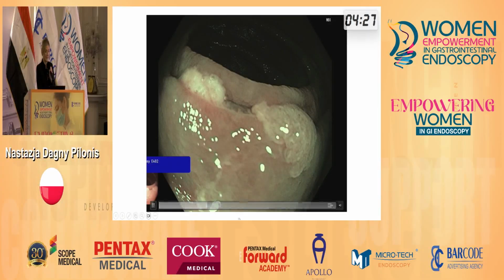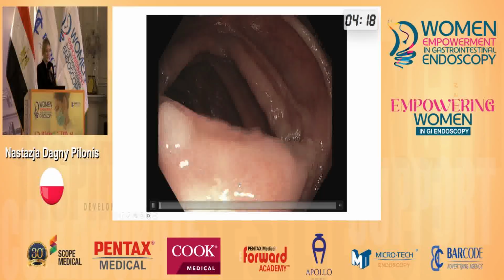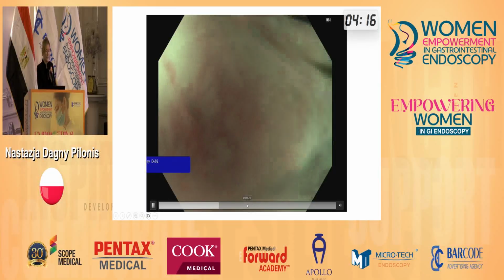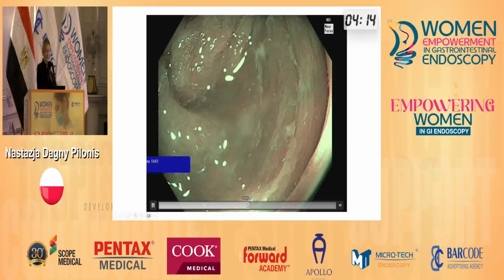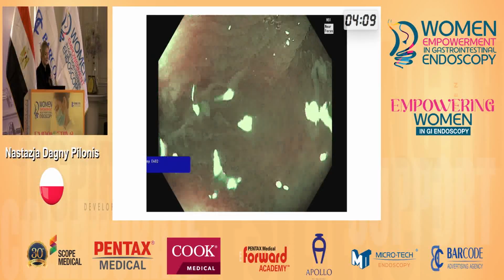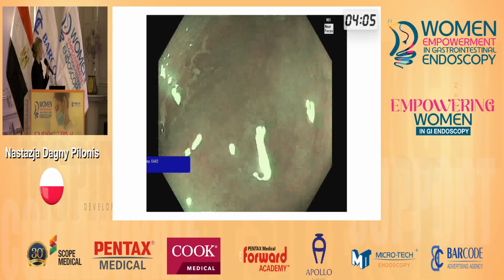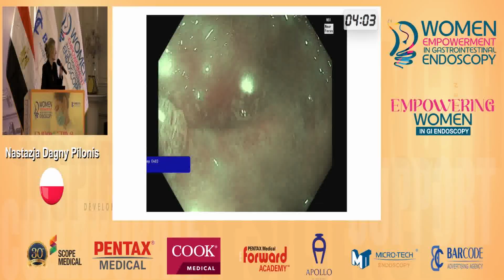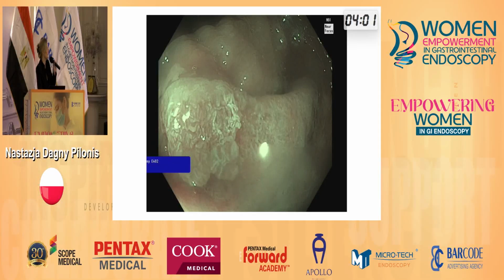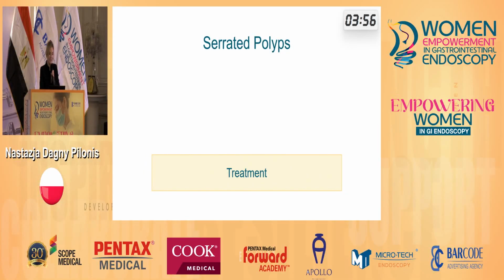And here you can see, when we switch on the contrast, we can actually delineate the lesion, and you can see this dotted line showed us this. For the sake of time, I can't go through the entire movie that I prepared, but I recommend you spend some time to look for those features that we discussed: clouded surface, irregular surface, and dark spots.